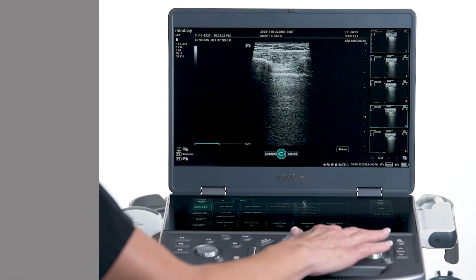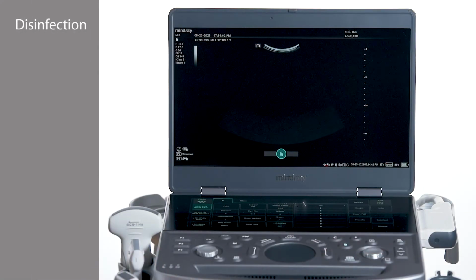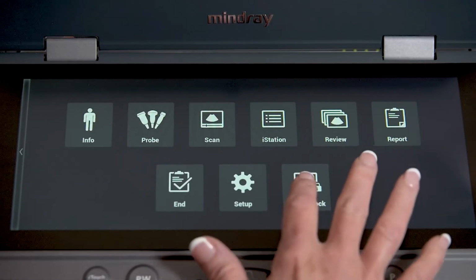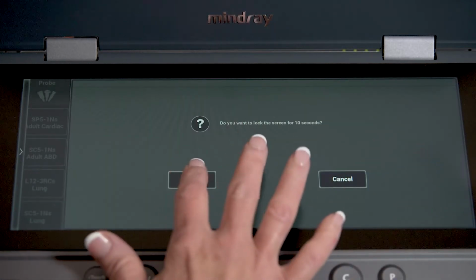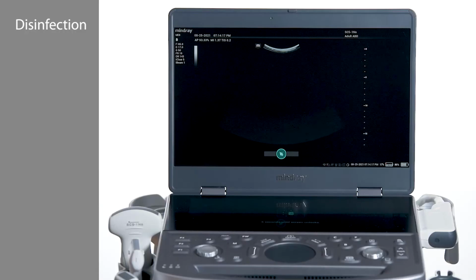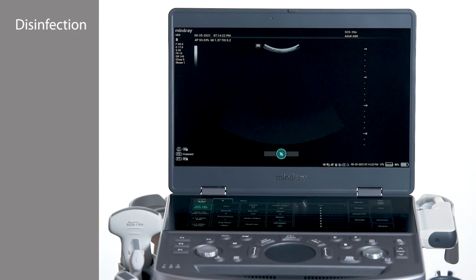The ME8 is easily cleaned and disinfected using an approved product. To clean the touch panel without changing any imaging parameters, select Screen Lock from the menu screen. This will lock the touch panel for 10 seconds in order to disinfect without accidentally changing any settings on the system. Use approved disinfectants only on the user interface.